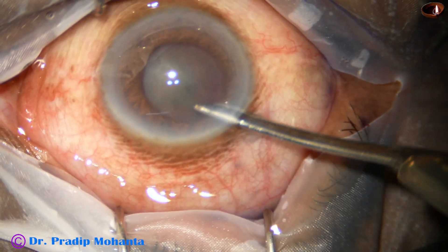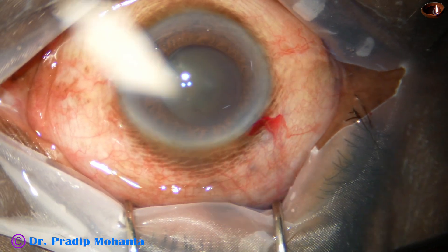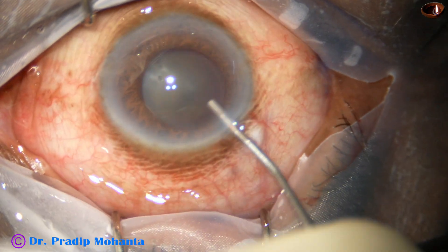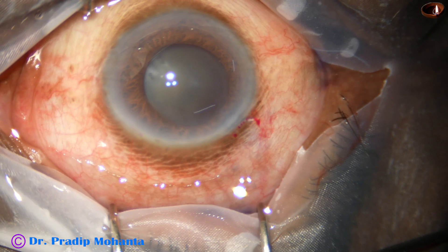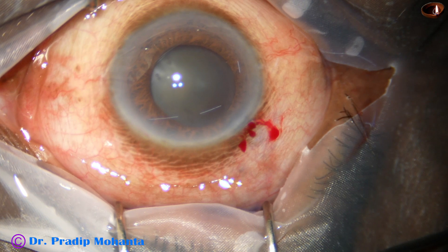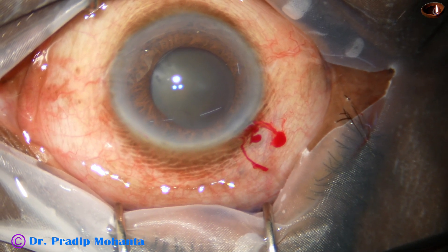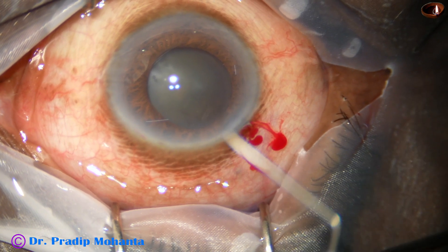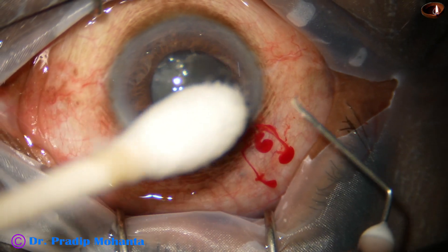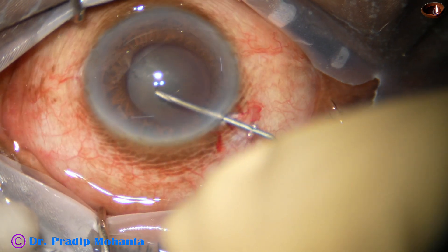I always wash the dye out so that there is uniform dye in the aqueous. If we do not wash the dye out of the anterior chamber, there will be higher concentration of dye at one place and low concentration at another place in the anterior chamber, and that causes some degree of low visibility.